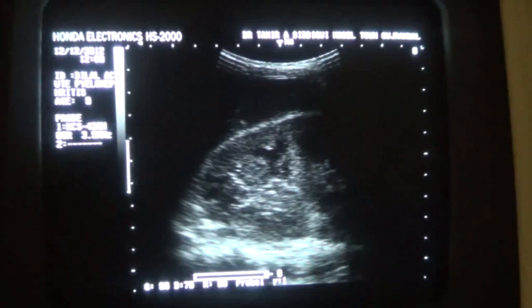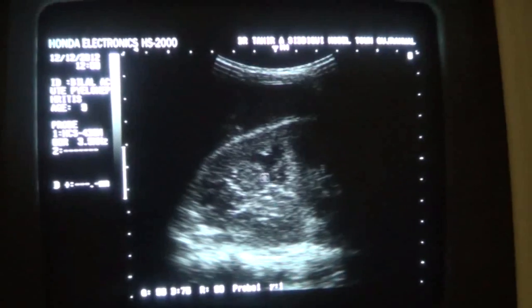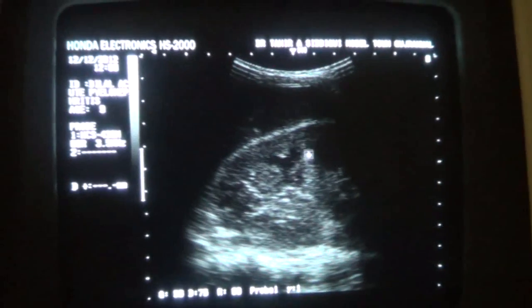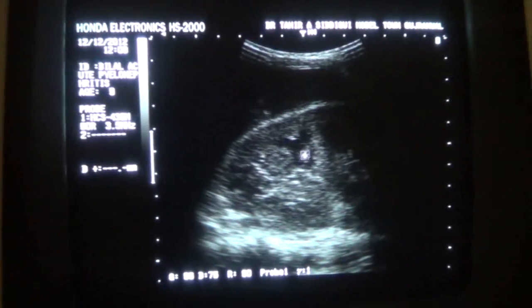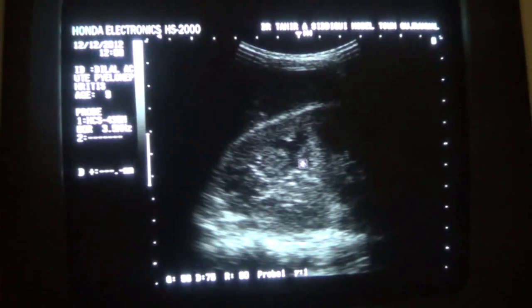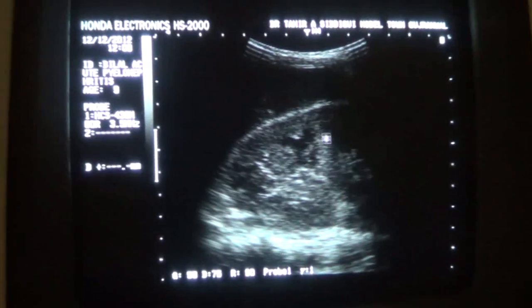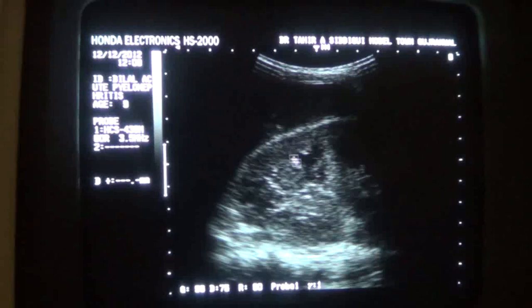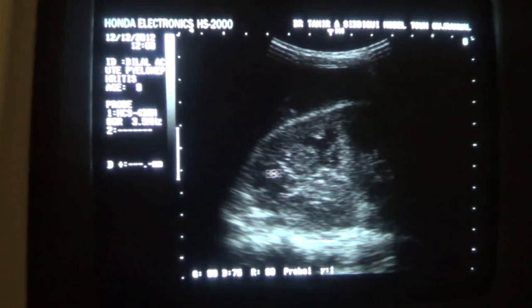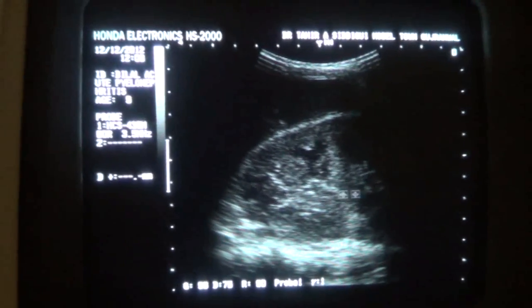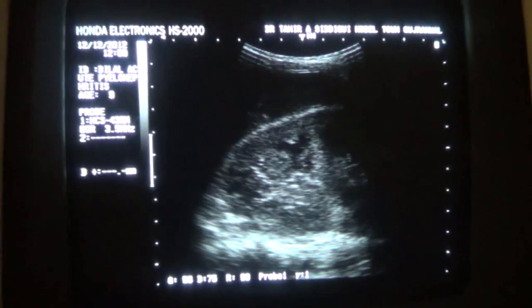See the fullness of the pyramids. This is a pyramid. Note the echogenic fine sand-like particles within this significantly dilated pyramid. This is the second one — it is full of internal echoes. The central sinus echo complex is rather muffled.